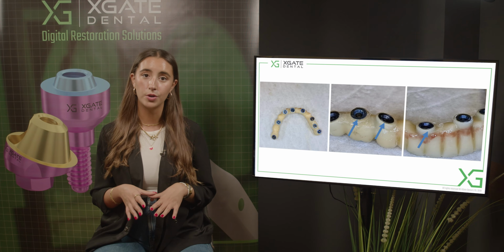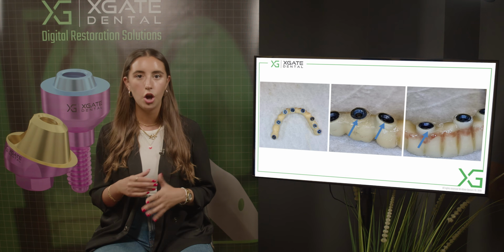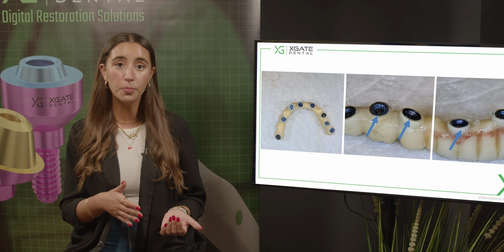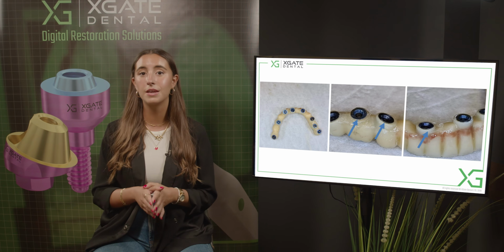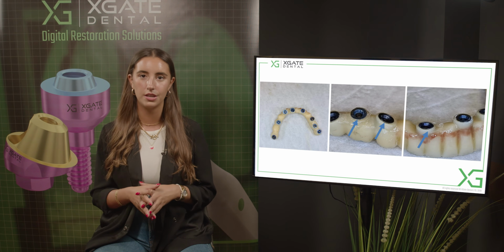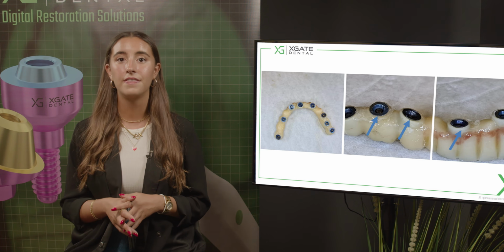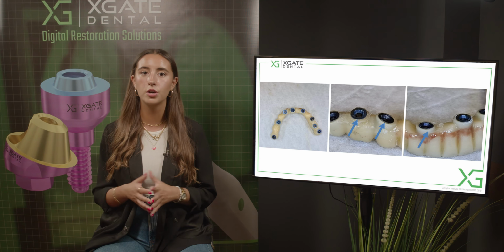Then we milled the zirconia, and then the cementing process inserted some deviation. All of these deviations are going one on top of another, and then in the final process, you get some part of inaccuracy. If you didn't do it in the same way, you wouldn't see this inaccuracy. You'd just have internal forces in the zirconia bridge.